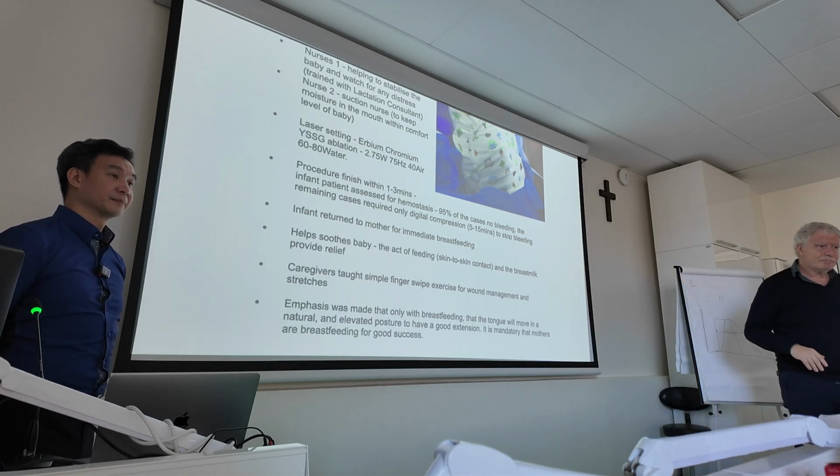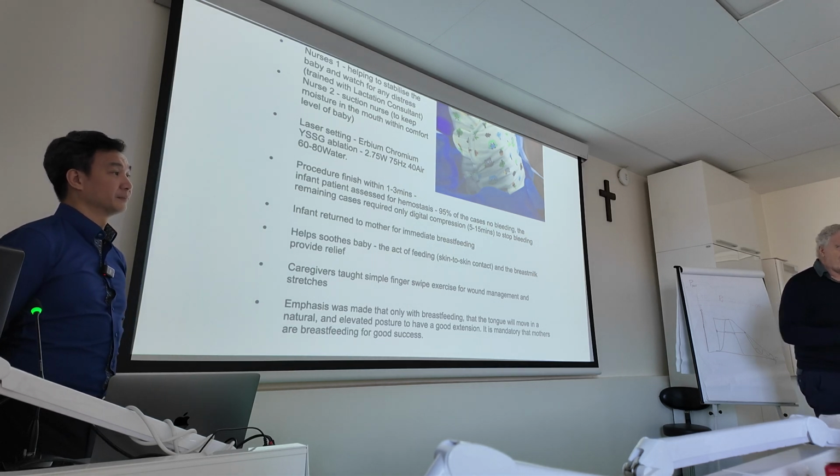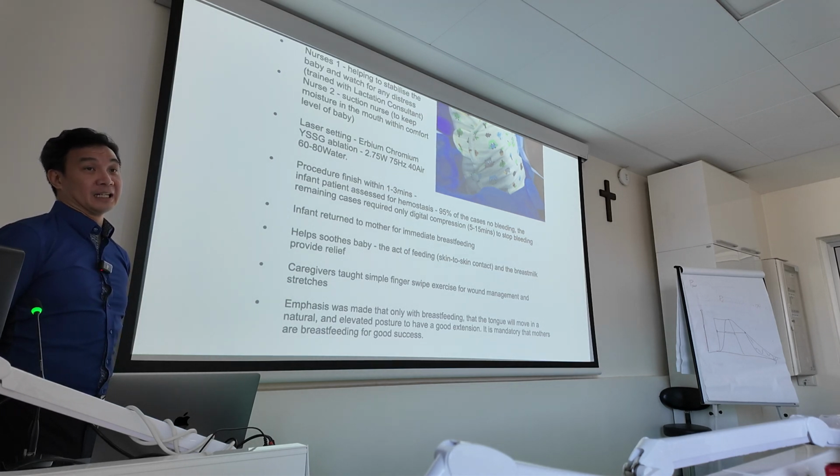I've been using a straight handpiece just for a few months. Or can you say the diode is a better option or not? Diode is an option, he will say, but I will tell you he will say no. It is in the hands of a very good laser dentist.